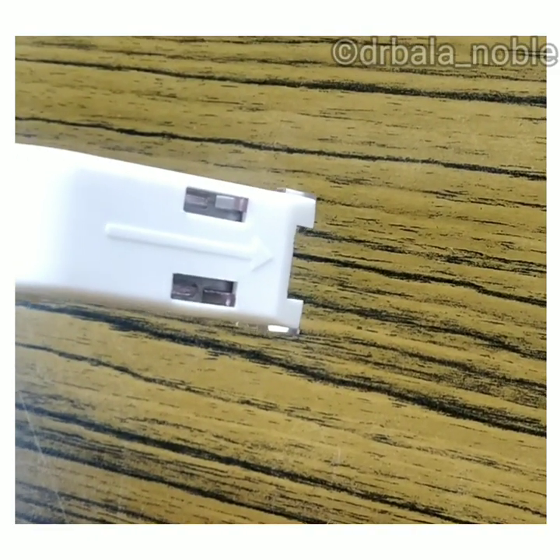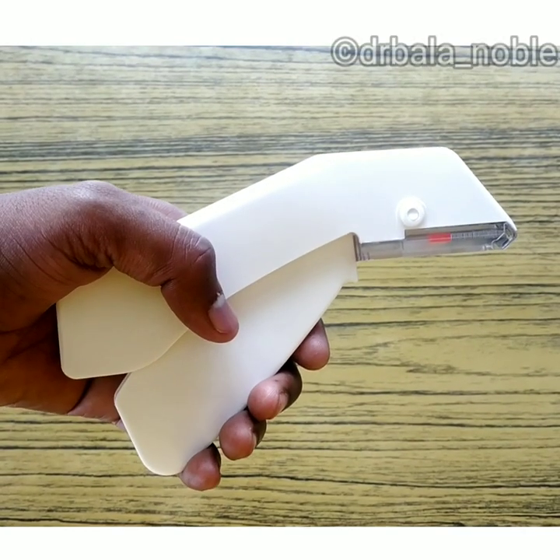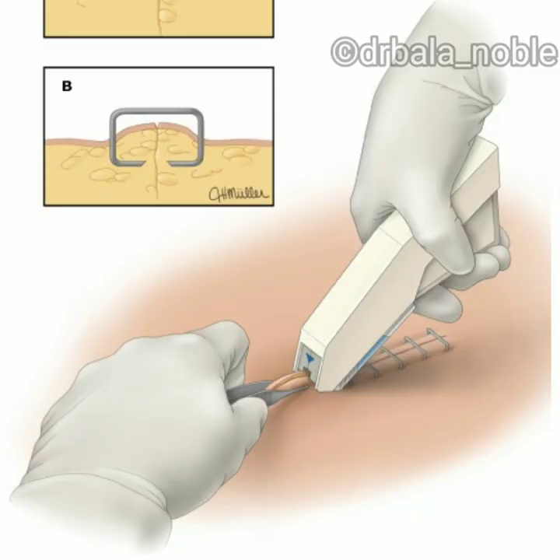Look at the arrow mark — that should be placed at the center of the wound margin. Hold the stapler like this against the wound margin and press, so it will release the pin. Hold the edges very closely and evert the margins with the finger or forceps.